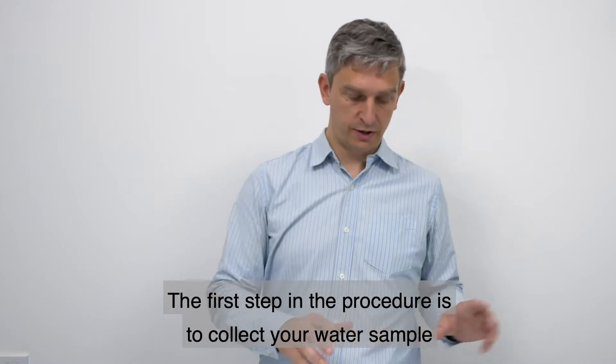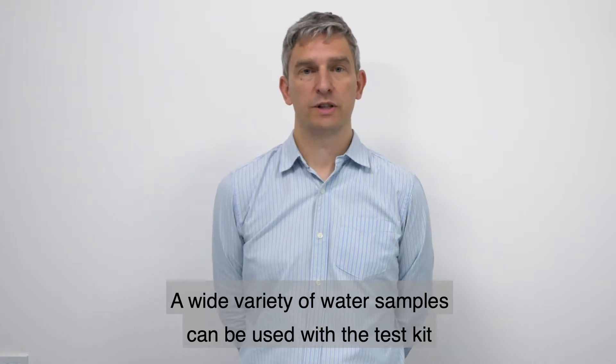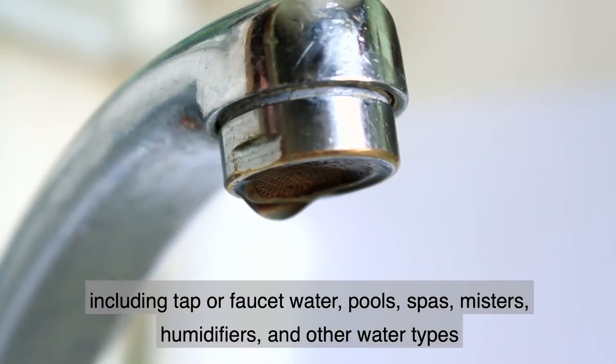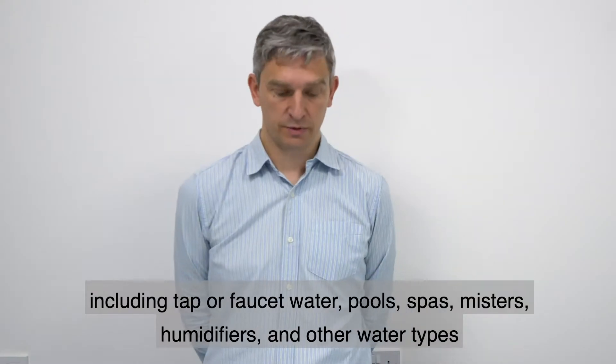The first step in the procedure is to collect your water sample. A wide variety of water samples can be used with the test kit, including tap or faucet water, pools, spas, misters, humidifiers, and other water types.